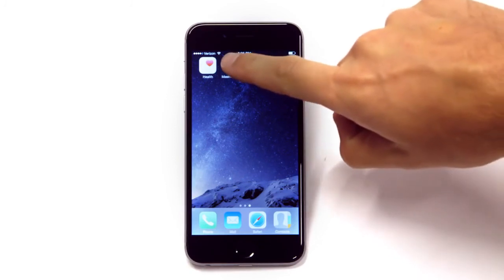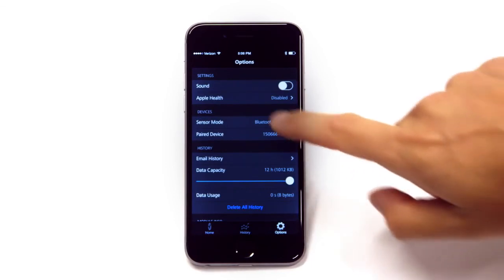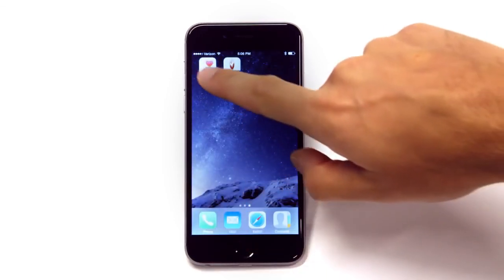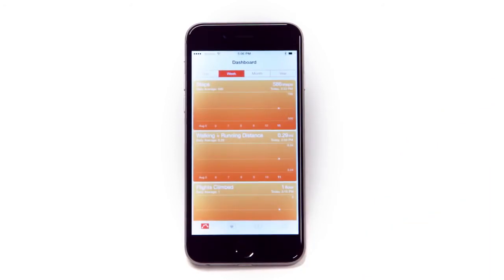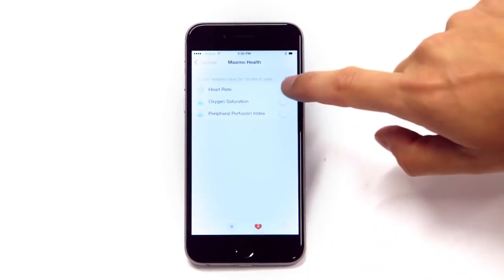Additional features of the Masimo Professional Health App include the ability to share data with the Apple Health App. To share data, open the Apple Health App, tap on the Sources icon, and enable the parameters to allow Masimo Health to write data.